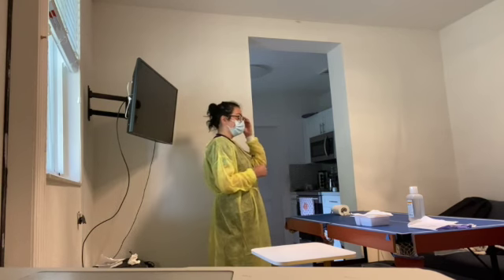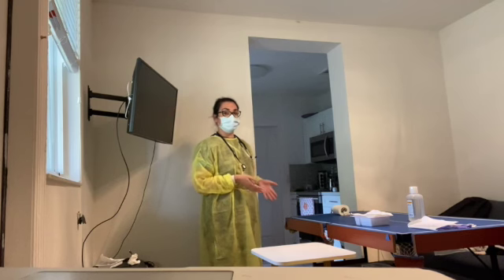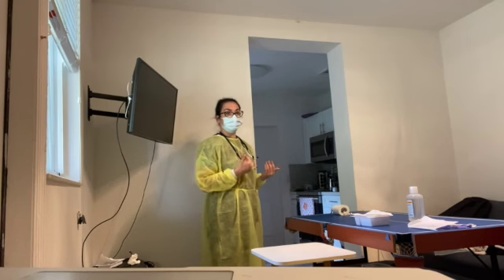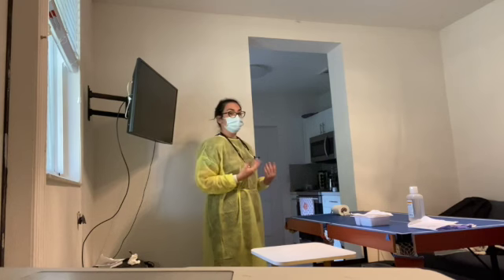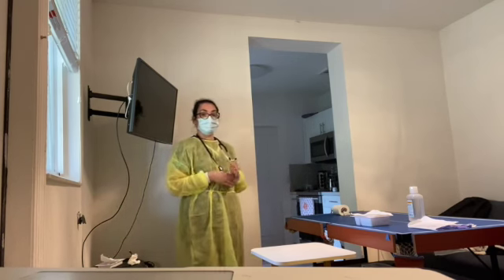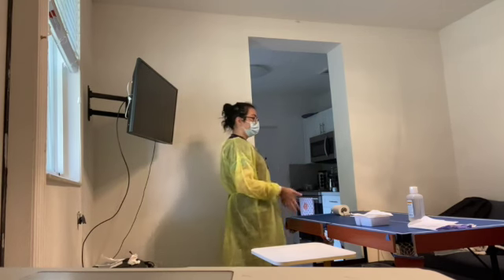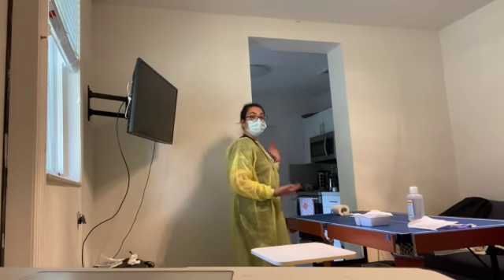I have educated the patient on why we are doing this today. We are doing it to avoid any infections and make sure that there are no infections or abnormal inflammation. The patient understands, and I will now be providing the patient with privacy. I'm going to be washing my hands and donning regular gloves. I'm going to be placing the patient in a high Fowler position.